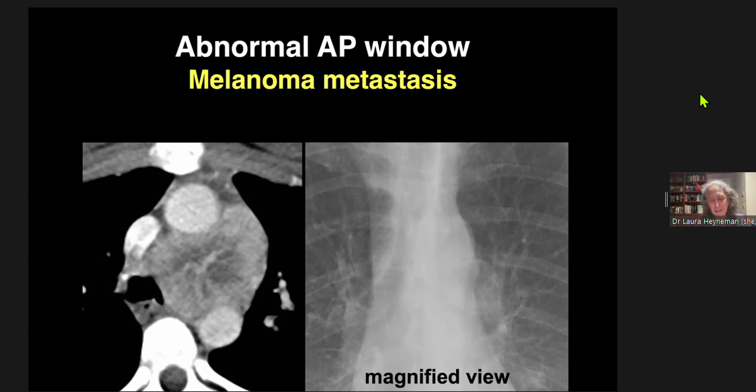Okay, so I'm going to stop there. AP window, AP line. Questions about that?